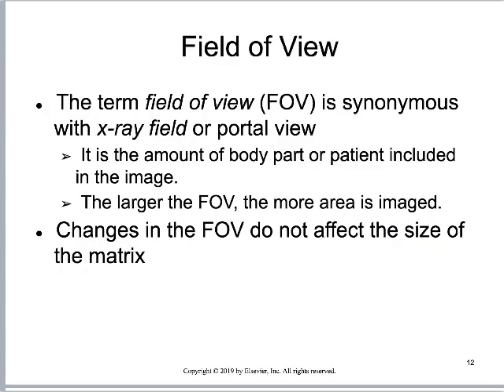Here, to go back to Mr. Horner's question, here's the one thing you can control about this. You cannot control matrix size, right? Whatever pantyhose size the pantyhose factory makes, that's what you're getting, right? What you can control is the size of the leg you're putting those pantyhose on. You can control the field of view.